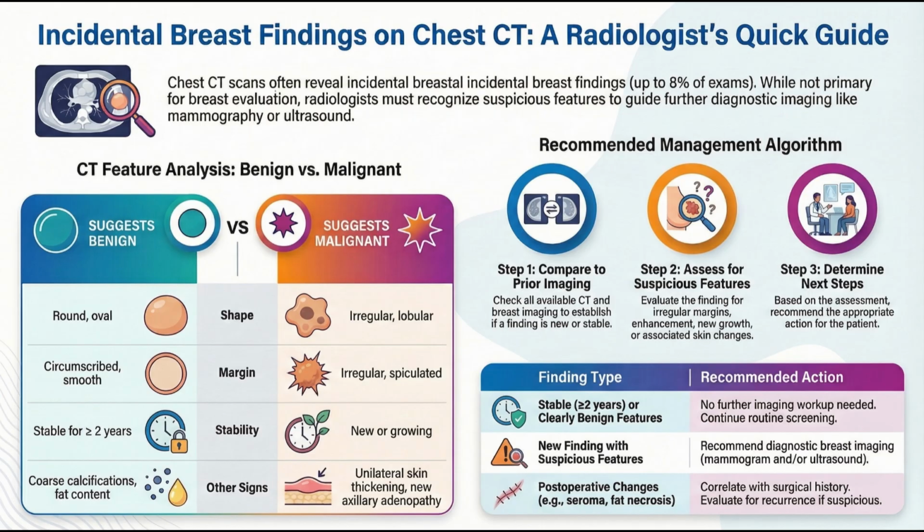Okay, so we've got our map, and we know to watch out for lookalikes. Let's talk about the tissue itself, specifically breast density. This has massive implications. Huge implications. Medically and legally. Density is just the ratio of that white fibroglandular tissue to the darker fat. And dense tissue has a dual risk, correct? That's right. 2 big problems. 1, it can hide cancers on a mammogram. It's like trying to find a snowman in a snowstorm. And 2, it's an independent risk factor for getting breast cancer in the first place.